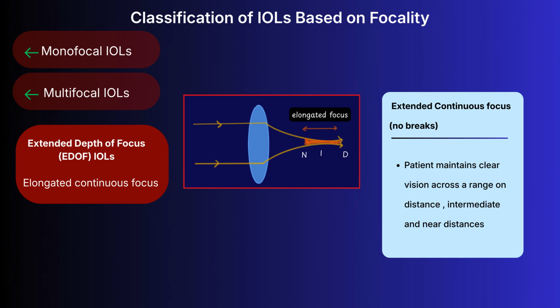Then we have the extended depth of focus IOLs or the EDOF IOLs. Instead of producing separate focal points, these lenses create an extended continuous range of focus. This allows the patient to maintain useful vision across a range of distances, particularly the distance and intermediate.